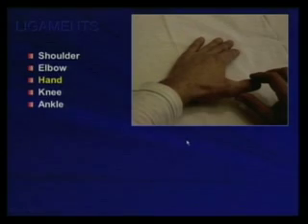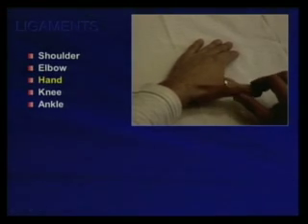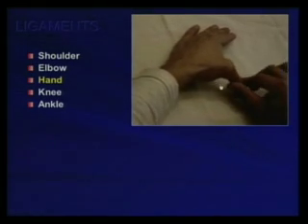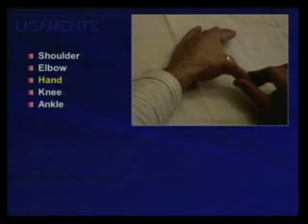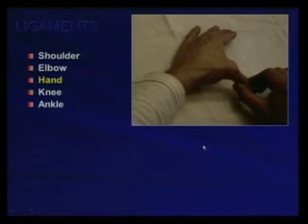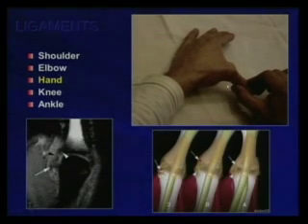We can check some ligaments with ultrasound. Some superficial ligaments are well visualized with ultrasound. Of course, we cannot see the ACL, PCL, but we can check for this ligament that is the ulnar collateral ligament of the first MCP joint, and you see the hyperabduction of this thumb. So we are going to check for this ligament. It's the ulnar collateral ligament of the MCP joint. So in this case, there is a tear. This is called skier thumb, when there is a tear of the ligament.